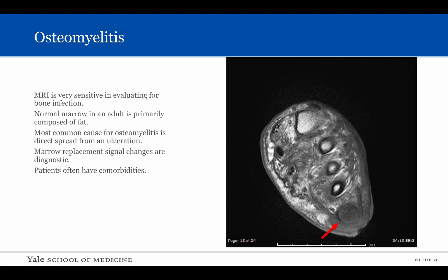MRI is very useful in evaluation of osteomyelitis. Normal adult bone marrow is primarily composed of yellow marrow. This patient had an ulceration along the lateral aspect of the foot and the normal fat signal within the fifth metatarsal has been replaced with the darker signal of the infected fluid.